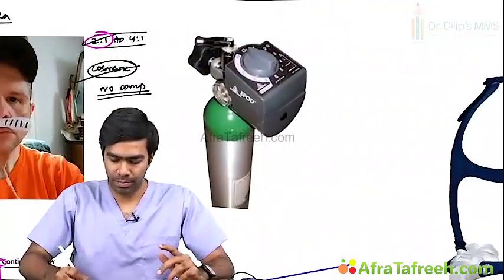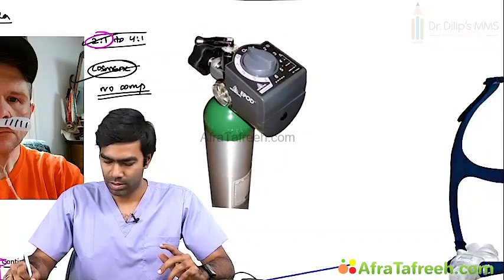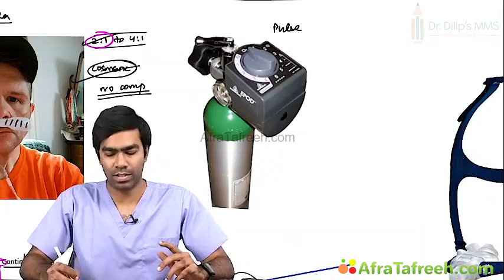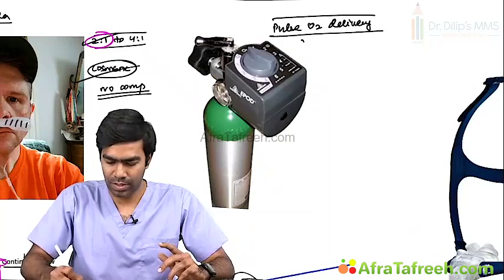These are called pulse oxygen delivering devices, pulse oxygen delivery, or otherwise referred to as a demand pulse.